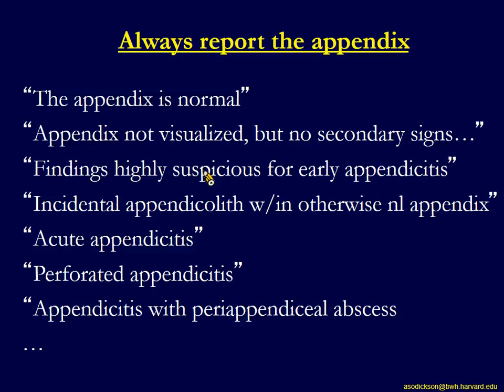You're right. I like to avoid uncertainty here. I don't like BI-RADS 3 for the appendix. I want to go with either normal or abnormal. Occasionally, we're in this very early gray zone where the findings are so subtle. I will usually make my decision one way or the other and come down with it.